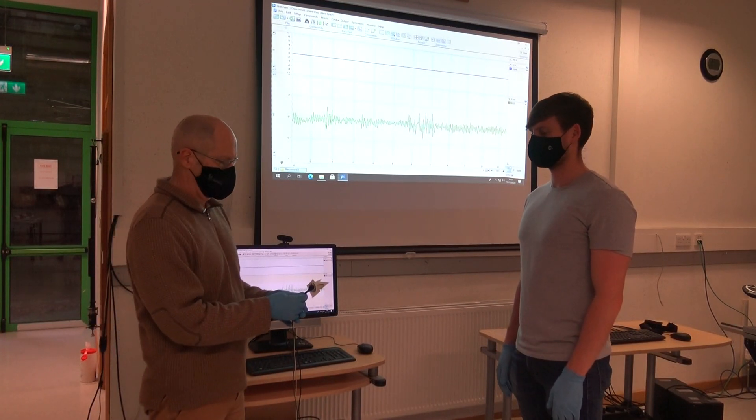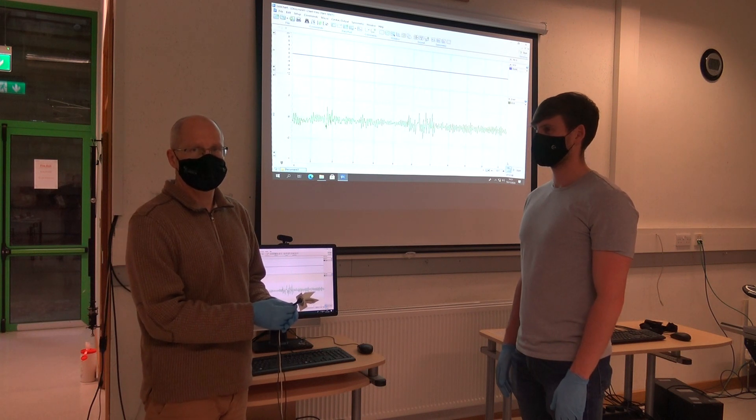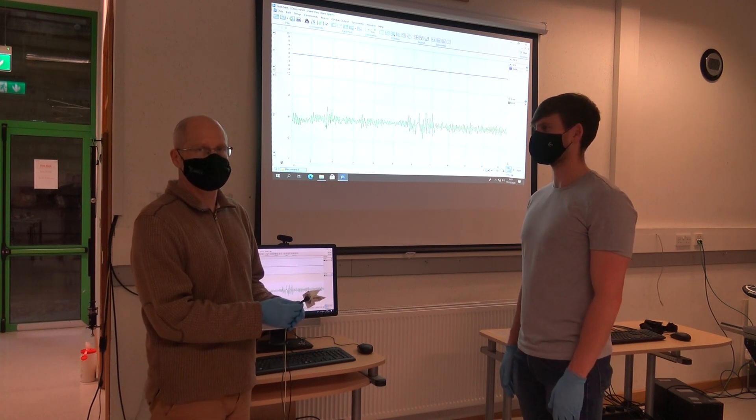Hi everybody, welcome to this lab on electrocardiographs on the ECG. In this first video we're going to show you how to set up the volunteer with the ECG lead and electrodes.